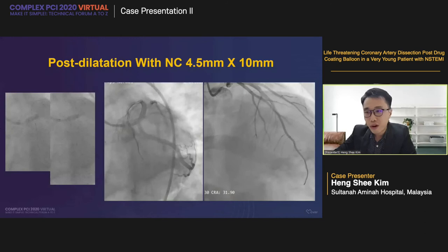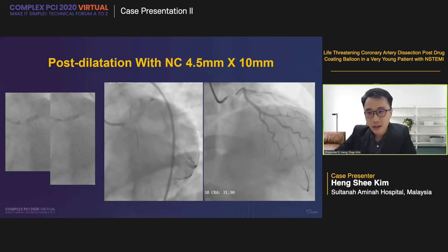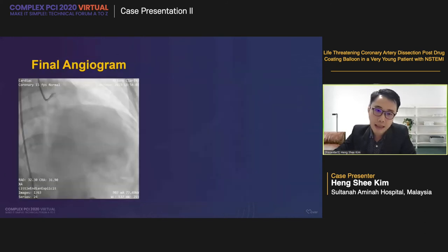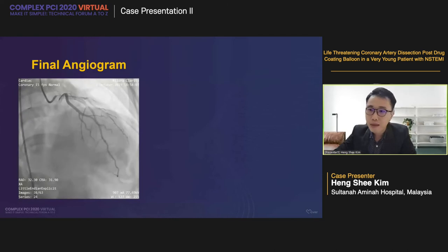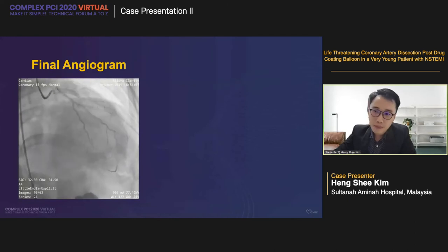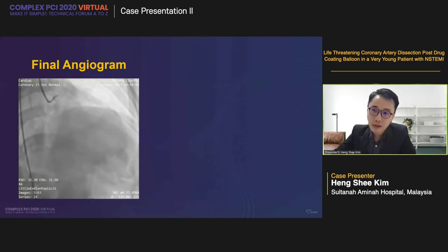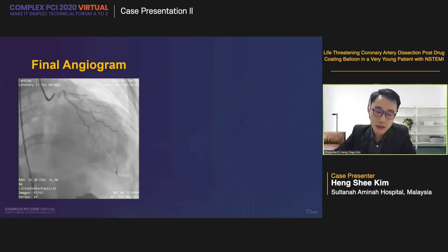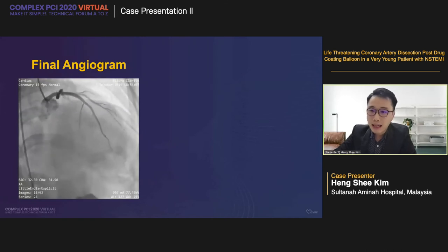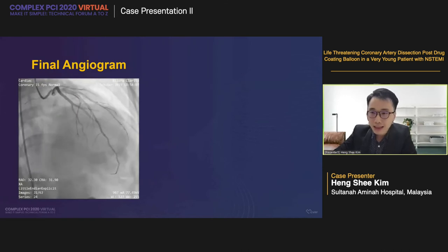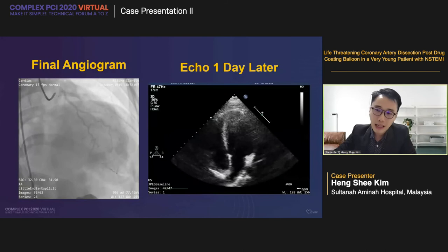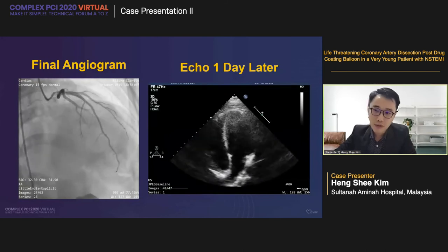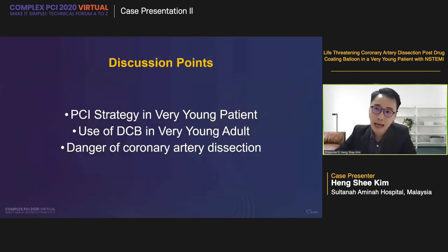After stabilizing the patient, angiogram showed TIMI-3 flow with some underexpansion of the stent. We post-dilated with NC 4.5×10 across the proximal LAD and high-pressure inflation over the left main. The final angiogram looked good. Post-procedure, the patient was fully conscious, achieved resolution of chest pain, was hemodynamically unsupported, and had resolution of ST elevation. His echo the next day showed preserved LV function, and he was discharged well after two days post-PCI.